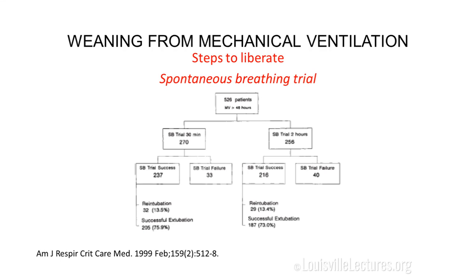And the timing, how long this spontaneous breathing trial is going to last, traditionally it started off with 2 hours. We do 1 hour here. There's evidence that just 30 minutes of spontaneous breathing trial is enough. So I like that. You don't want to keep the patient for too long on a spontaneous breathing trial.